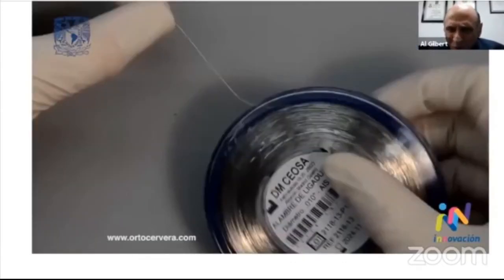Some universities, both in Mexico and abroad, contacted me to learn firsthand about how the robot works. Let me show you a short video they downloaded around 10 years ago.